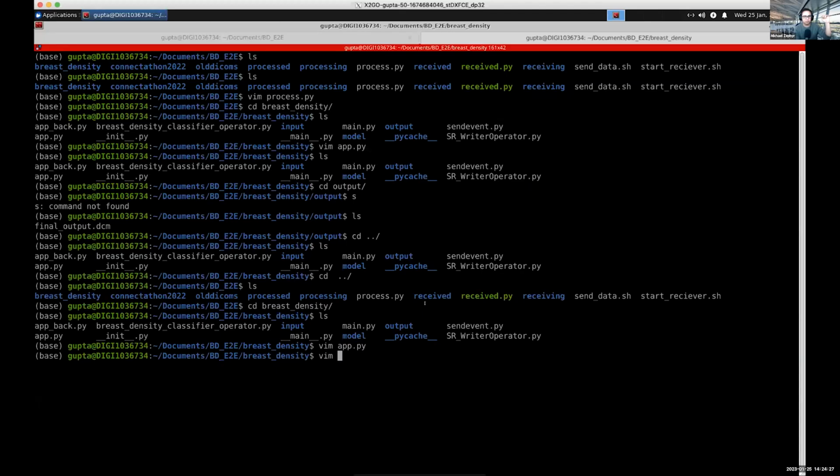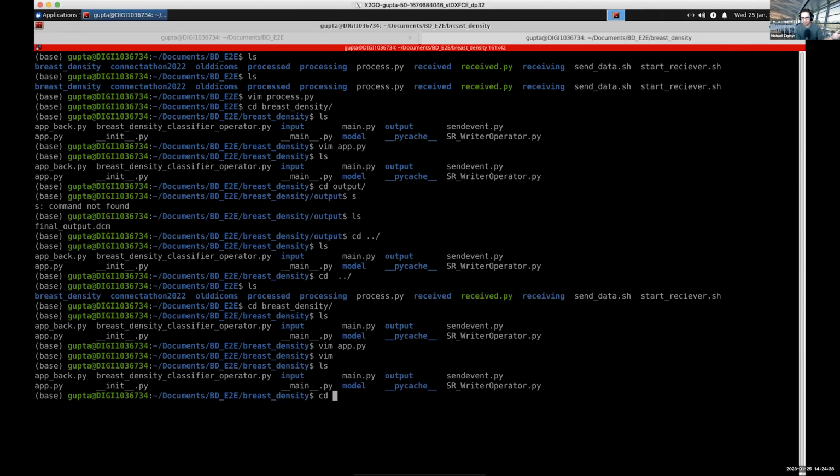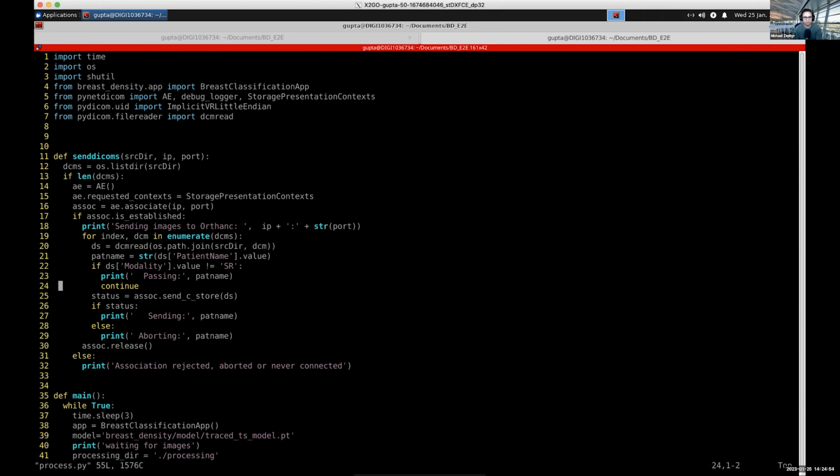Oh yeah, okay. And then I'm also going to put the MONAI Deploy Express link. It's in the MONAI Deploy repo, kind of 2 levels down, so I'll put that in chat as well. That way people can take a look at it if they're interested in some of the workflow manager, Informatics Gateway kind of infrastructure and other things that are set up in there. It's not quite this one that Vikash is showing, but for some of the other people who have asked just what is Informatics Gateway, workflow manager, how is it used, how is it tied into the system, it gives a nice single node example of what that might look like. So I'll put it in both Zoom and Discord here in a moment.